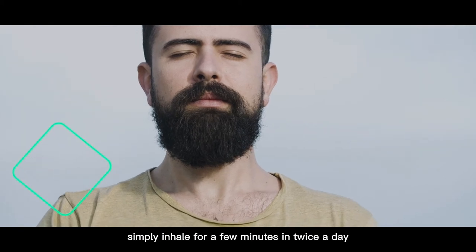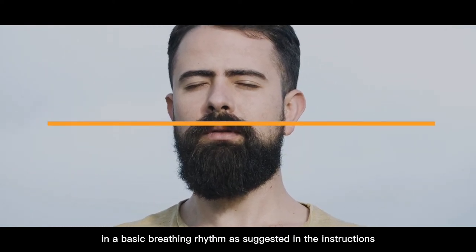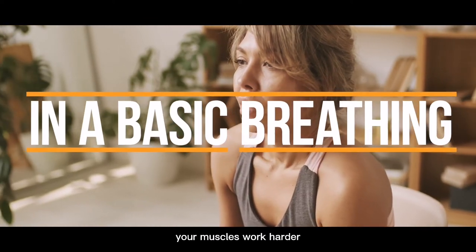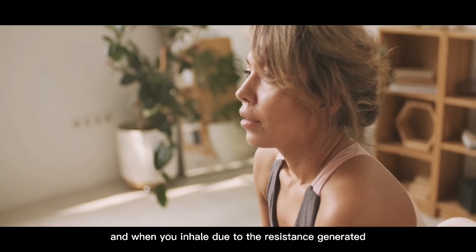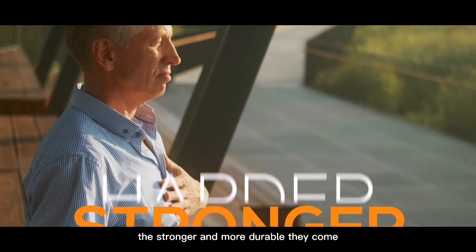Simply inhale for a few minutes twice a day using the Lung Exerciser in a basic breathing rhythm as suggested in the instructions. Your muscles work harder when you inhale due to the resistance generated, and the harder they work, the stronger and more durable they become.